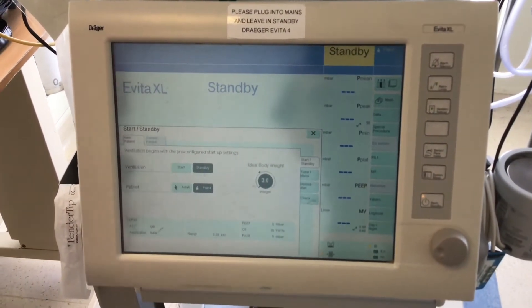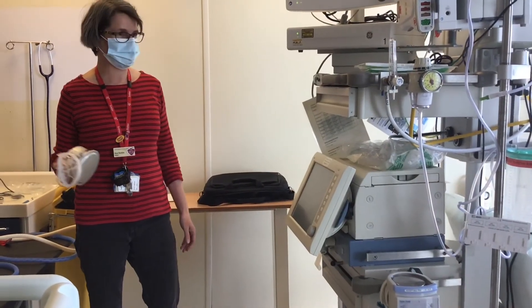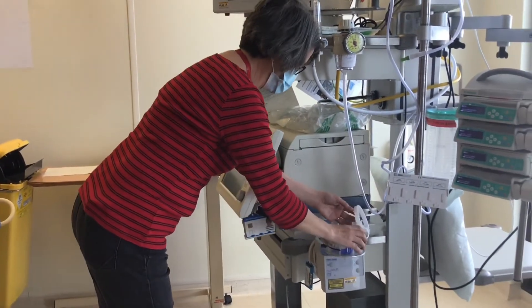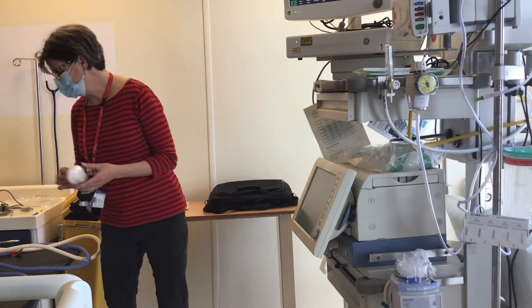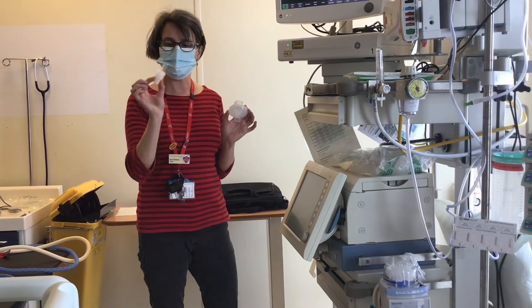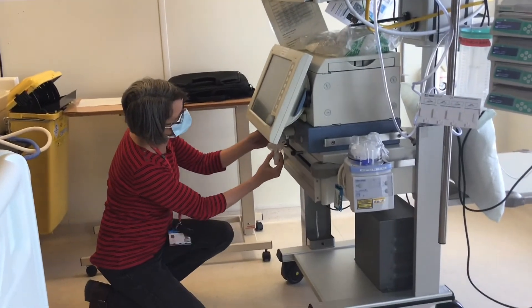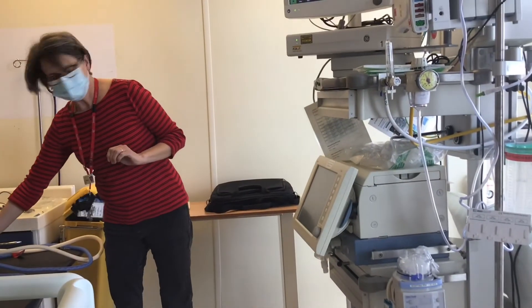This is setting up the Evita ventilator with pediatric ventilator tubing. Connect your humidifier as you would normally. You will then have your bacterial filter, and same as the other one, you would have your white and clear filter — this goes into your bacterial filter and then onto the expiratory valve.